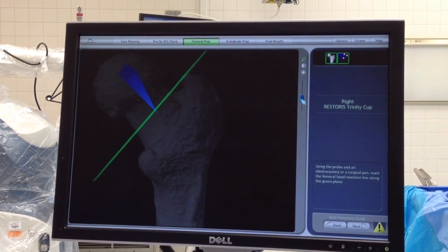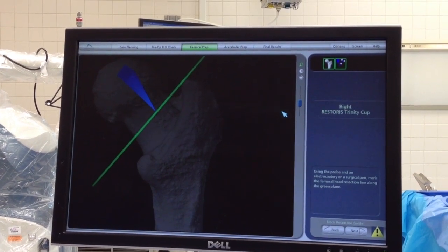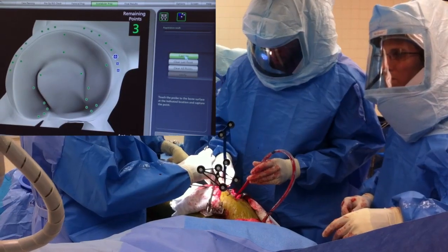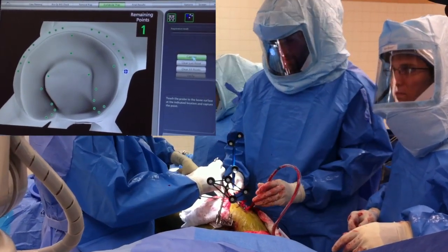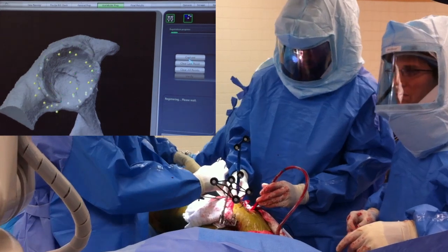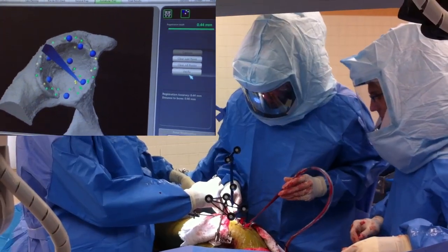Here we're marking the cut for the femoral neck, which we then make using a saw. Subsequently, we'll register the acetabulum, or socket. Again, this is done using a probe and a three-dimensional model based off of the CT.